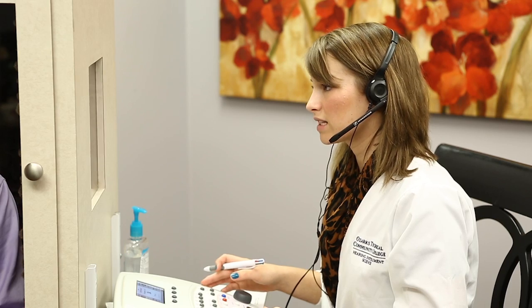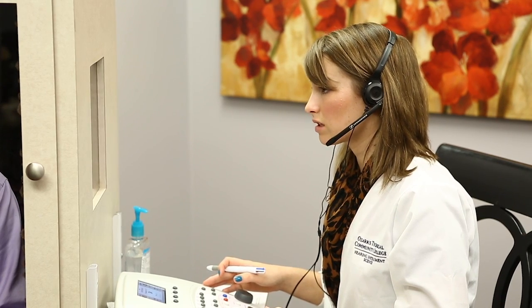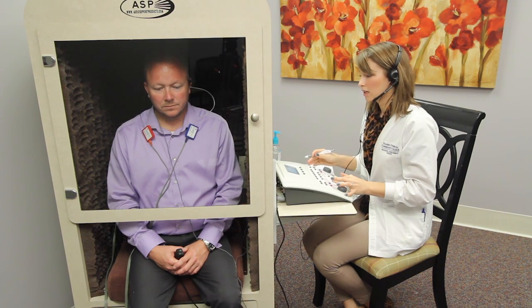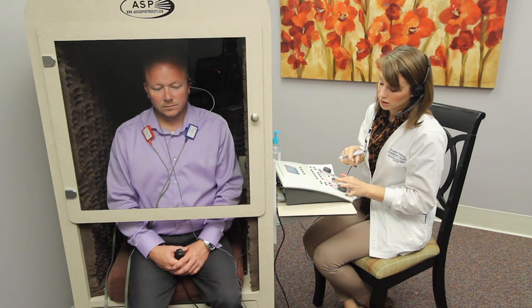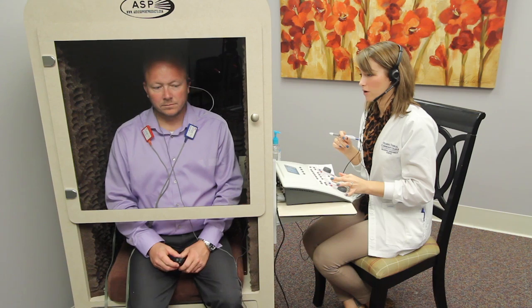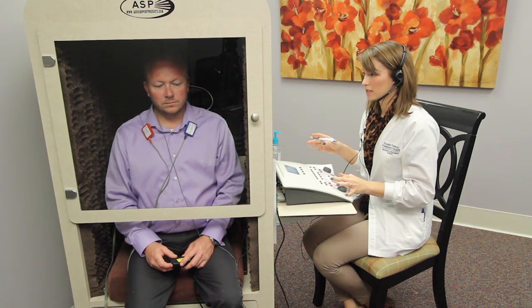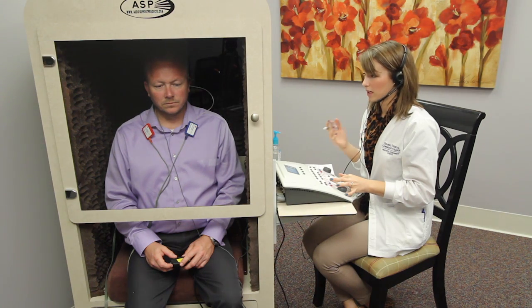So the next test we're going to do is bone conduction testing, and you're going to be hearing the tones through that oscillator behind your right ear. The tones are going to get softer and softer until you can't hear them any longer. What I need for you to do is push the button every single time you hear a tone — even if you think you hear it. In your left ear you're going to hear some static noise, and I'll need for you to ignore that.